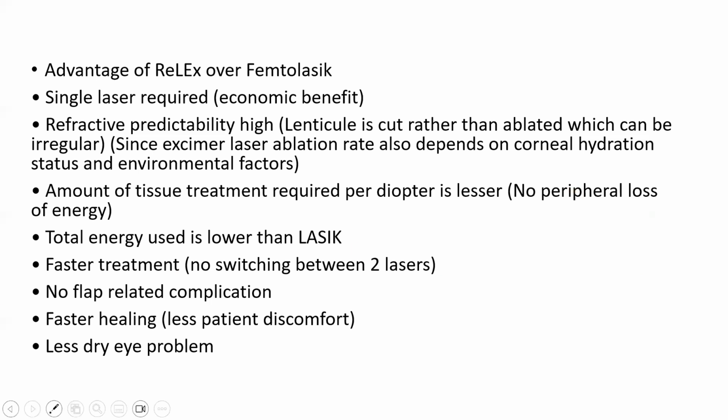There are a few advantages of ReLEx over femtoLASIK, which being that only a single laser is required. So economically it might be more feasible. The refractive predictability is very high because the lenticule is cut rather than ablating the cornea with excimer laser, because the excimer laser ablation rate also depends on the corneal hydration status and the environmental factors like the humidity of the room and also the time we take for delivering the excimer laser to the cornea.